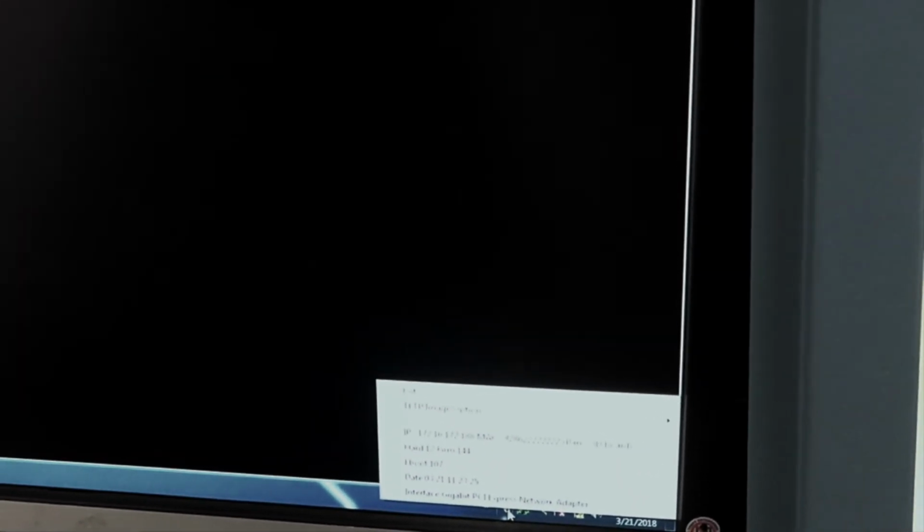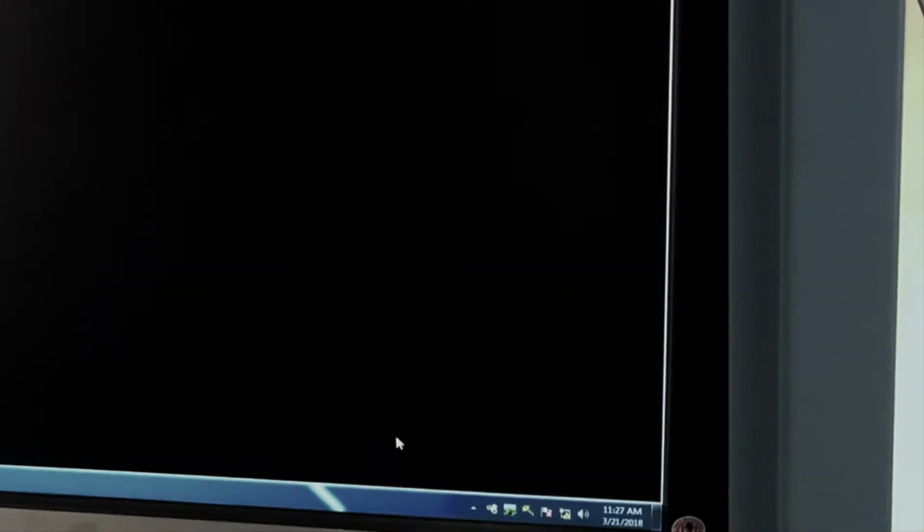There is one thing to be aware of in the software at the bottom right. The 3 gold rings shows that our unit is connected to the computer. If I turn the unit off, we will now see an error popping up on the screen showing we do not have connection. This here is showing that the unit is trying to configure and connect with the computer once again. Most likely you will need to turn the unit back on or call your customer support for further technical advice.